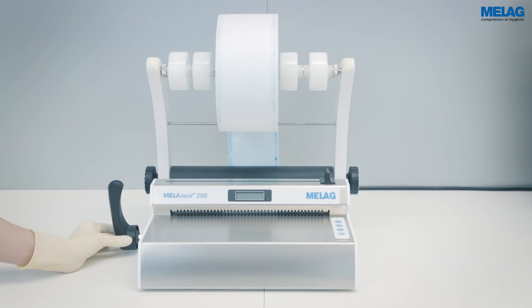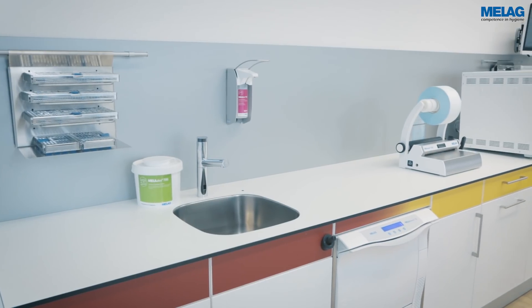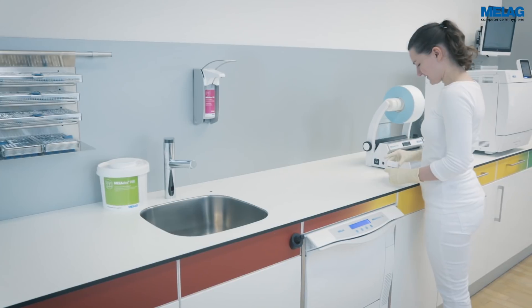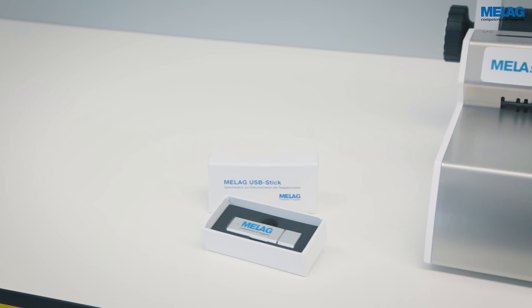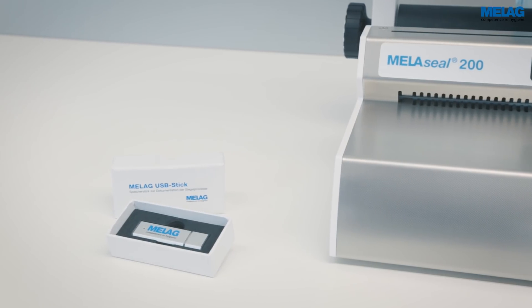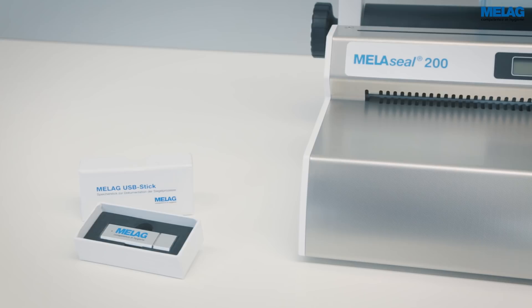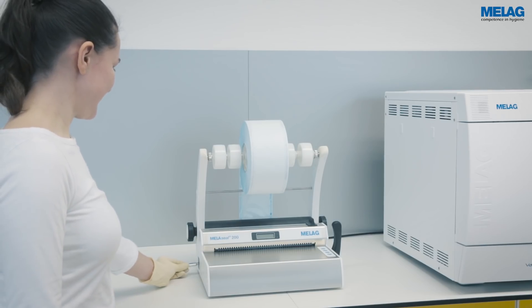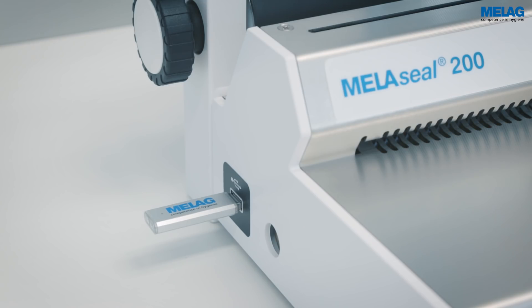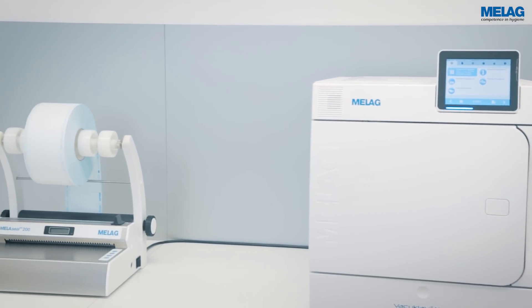The lever of the MELAseal 200 can be located on either the left-hand or the right-hand side of the device. Additionally, the scope of delivery includes a MELAG USB flash drive. The flash drive stores all the sealing logs safely. Please connect the USB flash drive on the left-hand side of the sealing device.